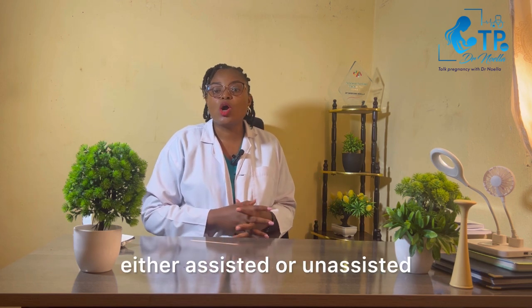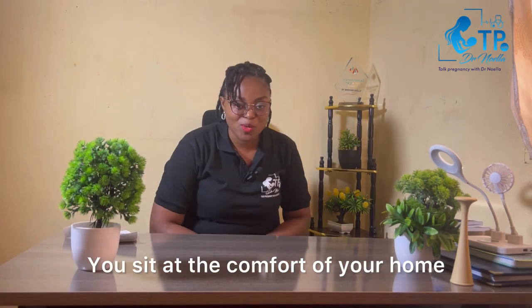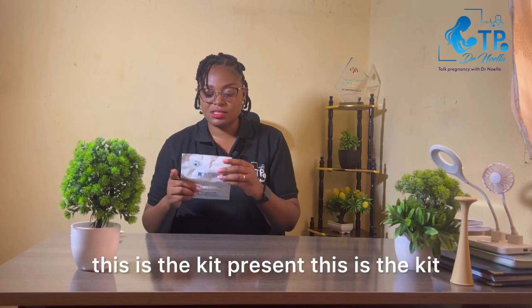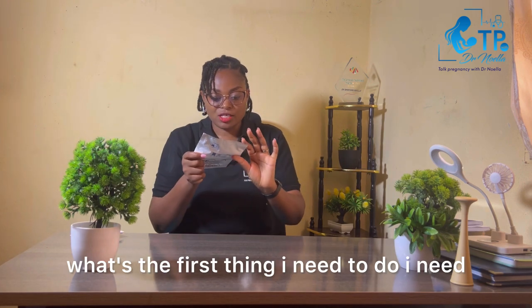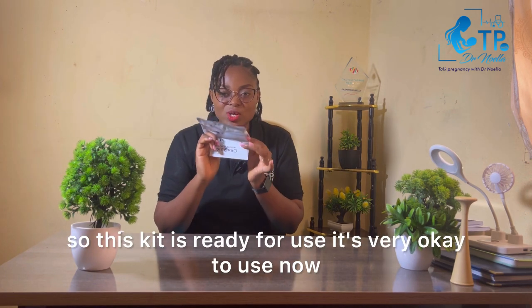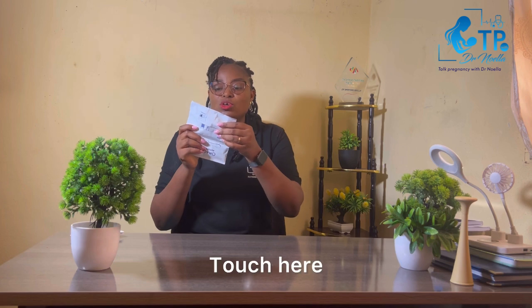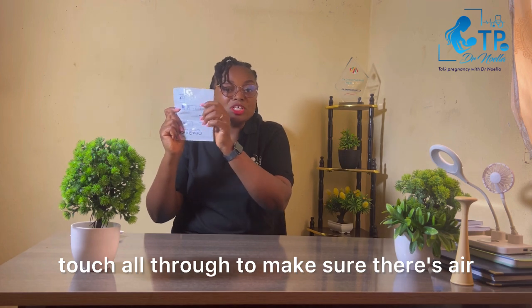Now you want to do your HIV test — how do you do it? You sit at the comfort of your home and relax. I have my HIV testing kit here. The first thing I need to do is check the expiry date. This one expires in 2025, so this kit is ready for use. Next, you touch the kit all through to make sure there's air inside.